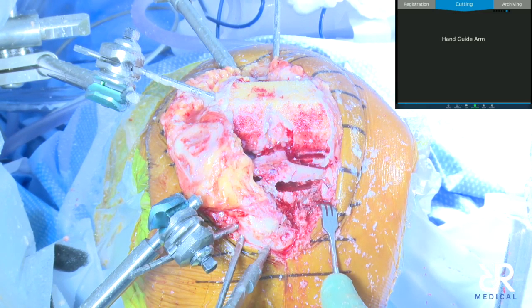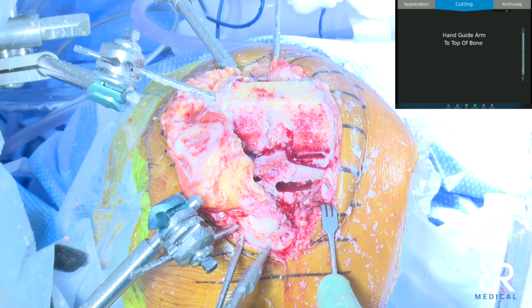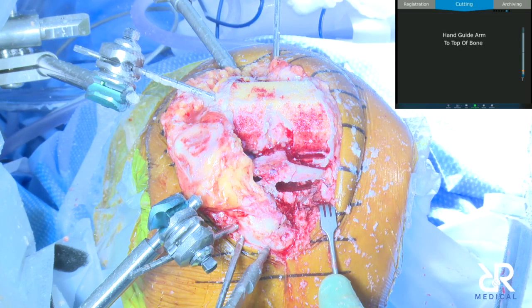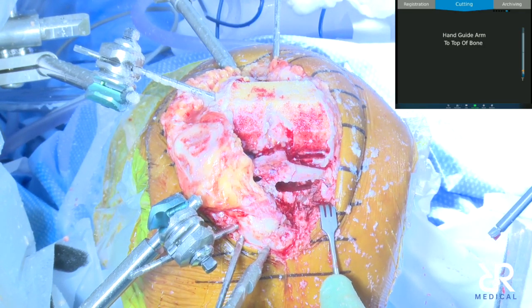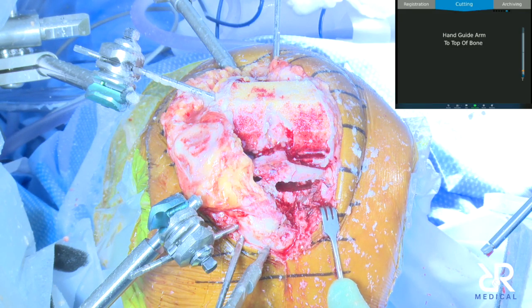Yeah, exactly. And you just really have to look at your plan, right? This is the kind of case you don't want to have your rep do the plan until you feel very comfortable. And you can't have any overcuts, posterior lateral, posterior medial. And you're probably a little more conservative when you do your first ones to really be inside. And then once you feel confident, then you get a little more aggressive. But it's definitely, you know, Luke, trust the force kind of deal.